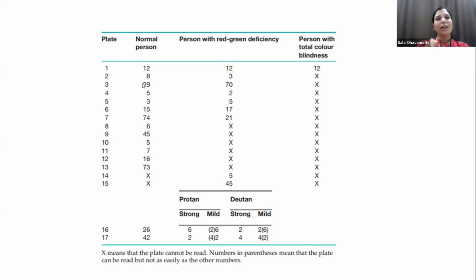Mainly, recording is very important for all the color vision tests. Here, although we check 38 plates, it is recorded as 25 by 25 or 16 by 16 correct responses, and you should record it monocularly, OD and OS. Pseudoisochromatic plates are mainly to pick up congenital defects, not acquired defects.